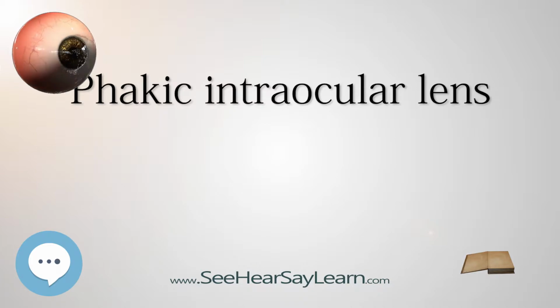Phakic intraocular lenses are safer than excimer laser surgery for those with significant myopia. Phakic intraocular lenses are contraindicated in patients who do not have a stable refraction for at least 6 months or are 21 years of age or younger. Pre-existing eye disorders such as uveitis are another contraindication.